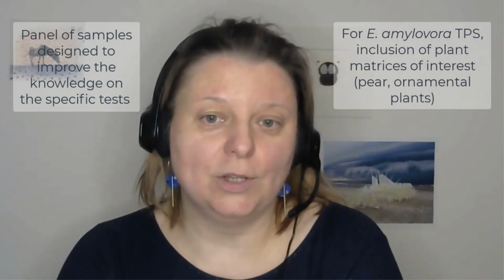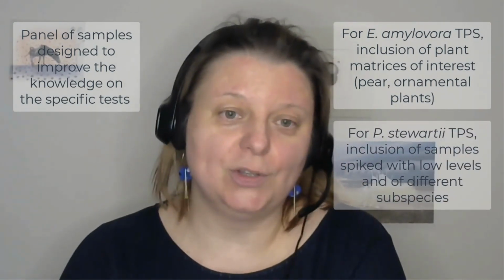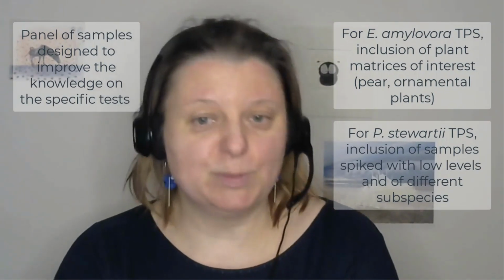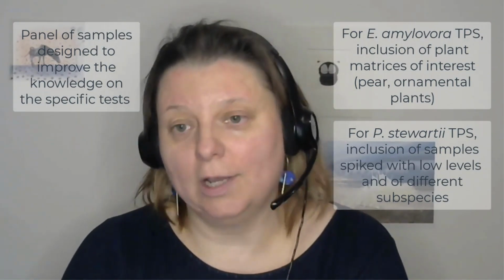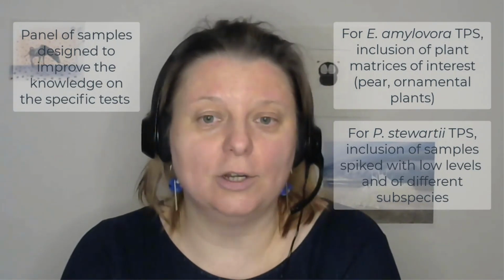The composition of the panel of samples was designed in such a way that it improved our knowledge of the specific tests and host plants included. So for example, for Erwinia amylovora, we know that there's a lot of data on apples, but we also wanted to generate new data on pears and on certain ornamental plants, and we've also included those hosts in the test panel. While for Pantoea stewartii, we know that the challenge is to be able to detect low levels of the pathogen and to differentiate between the two subspecies that can occur in such samples, subspecies stewartii and subspecies indologenes. So in that case, we had samples spiked with low levels of the target, and also some samples containing subspecies indologenes, which is cross-reacting in many of the molecular tests for detection.